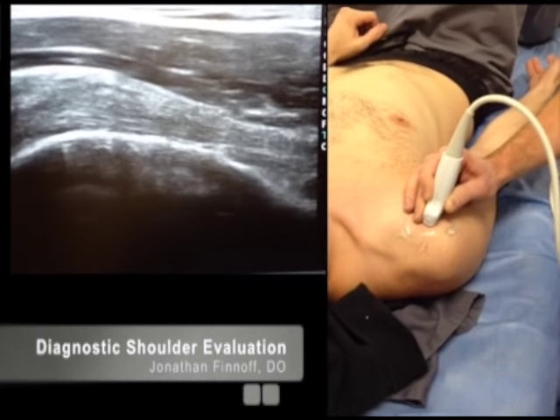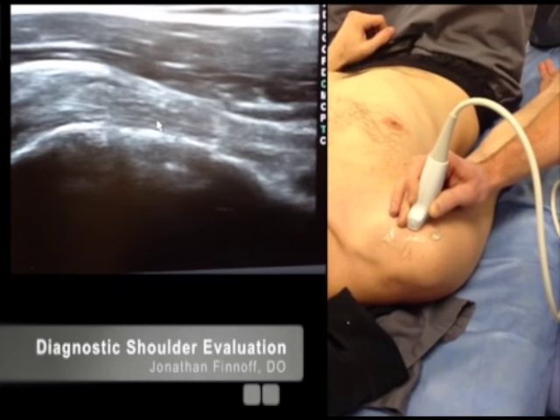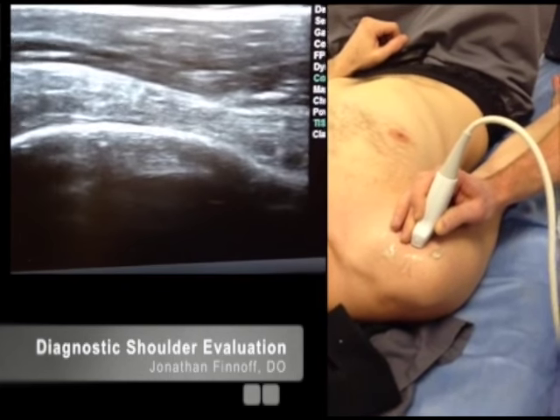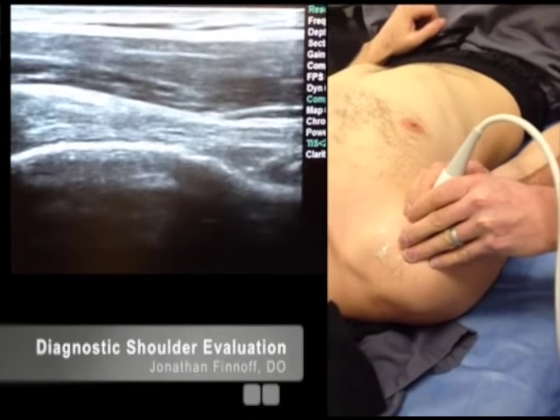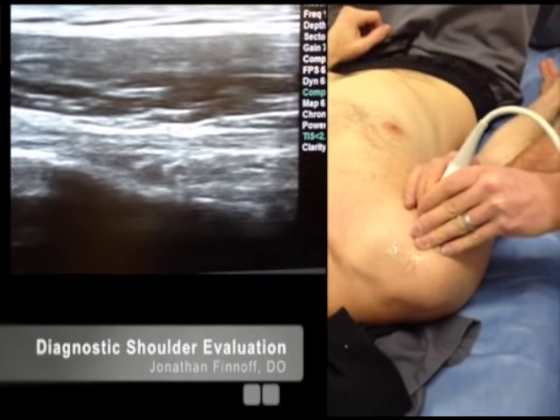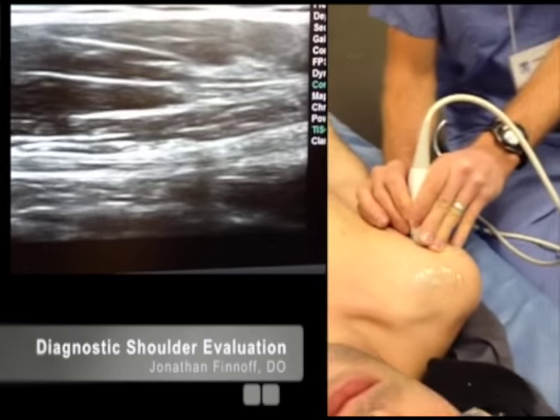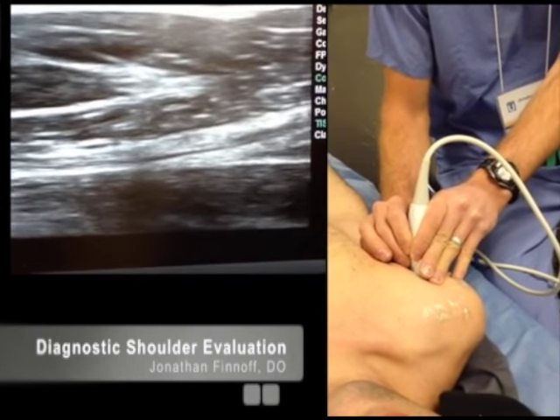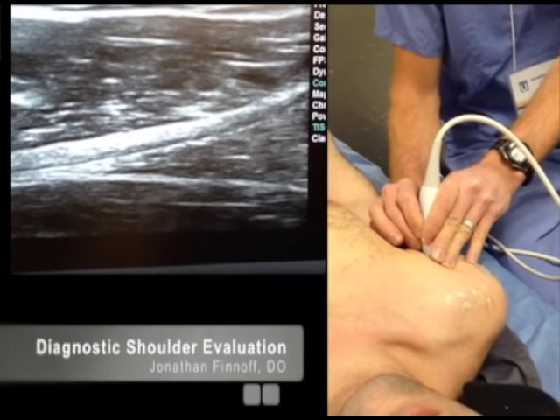There's the biceps tendon in long axis right here. I'm going to do a heel-toe maneuver in order to flatten it out. You can glide the transducer distally, holding your biceps tendon in the middle of the screen, and go all the way down to the musculotendinous junction, which is right down in that area.